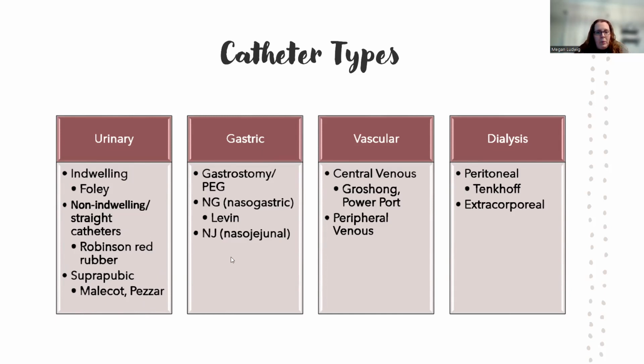All right, so the gastric catheters are usually to decompress the stomach. You can also use them to place nutrients in, if necessary, like a PEG tube, which you would place while you're doing an EGD. It's kind of like a 2-for-1 special there.